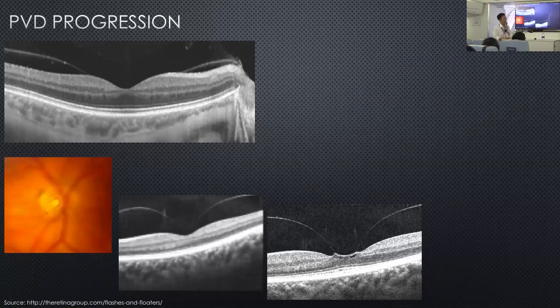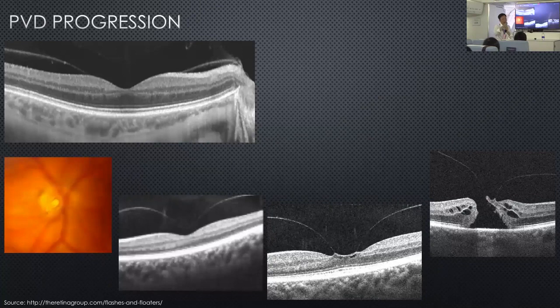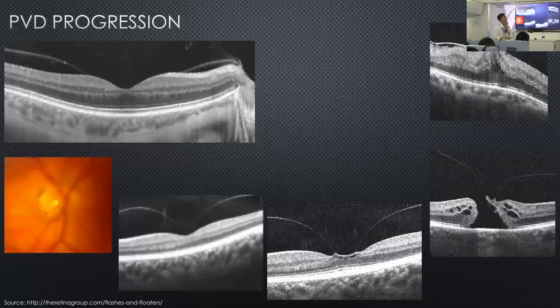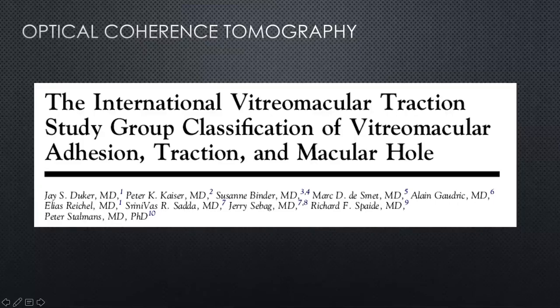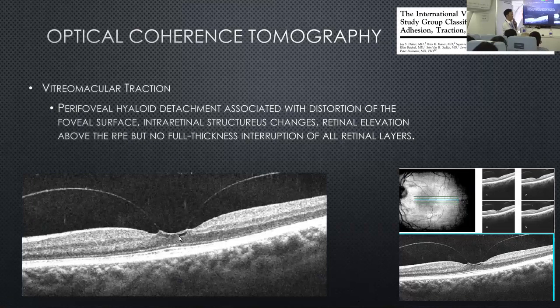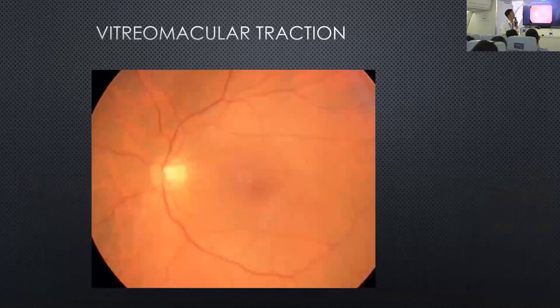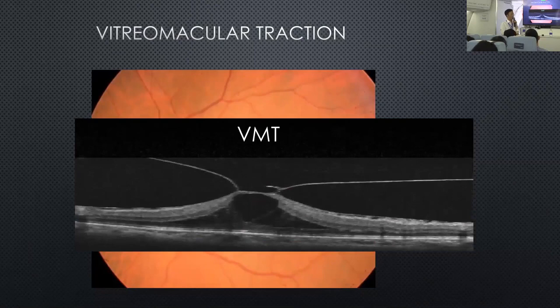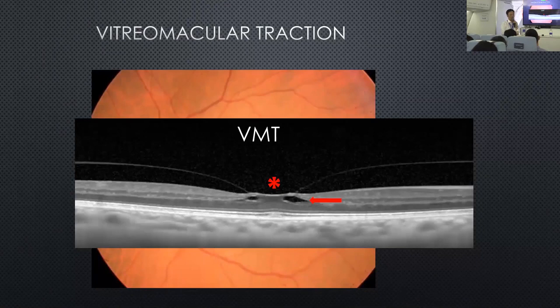You can actually follow sequentially how vitreous macular tractions can cause a macular hole. Traction is when there are structural changes in the retina, and the traction can cause splitting of the retinal layer depending on how severe it is.